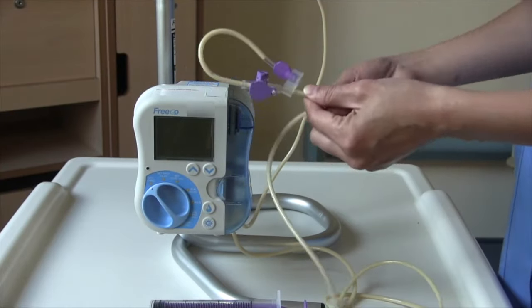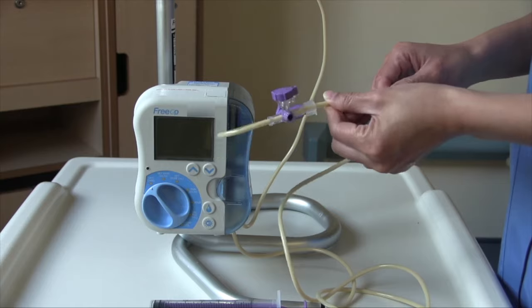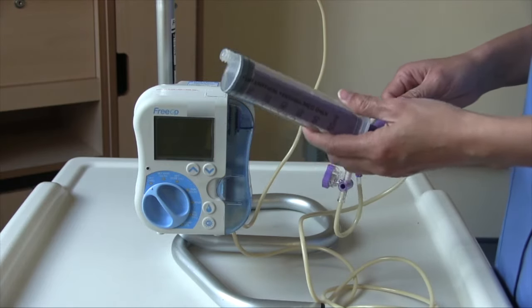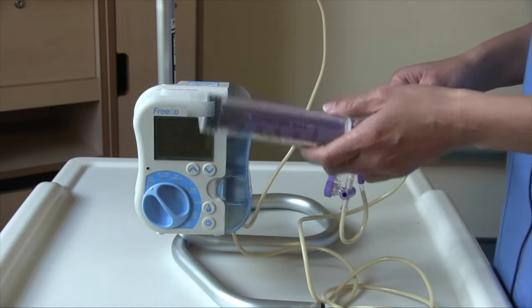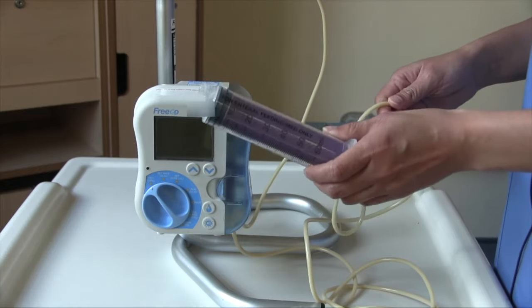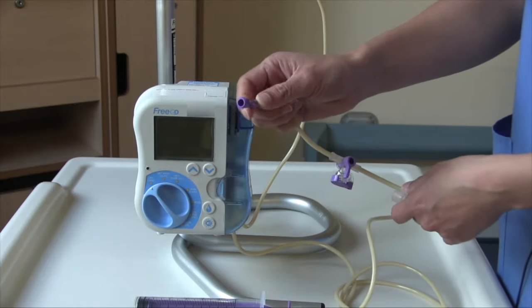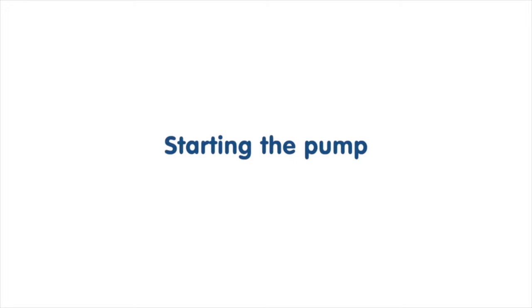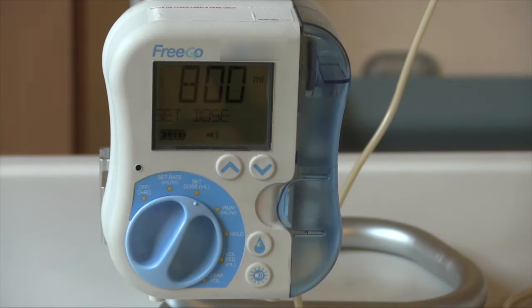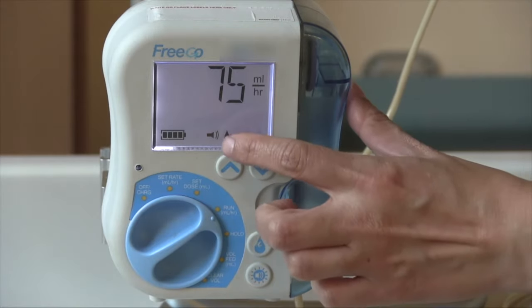After the giving set is primed and you can see the feed is near the end of the tube, and having set the rate and the dose, you are now ready to connect the giving set to your own feeding tube. But before you do this, you want to make sure you flush your own feeding tube with water. The amount of water you flush will be dependent on your feeding regime given to you by the dietician, to ensure anything left in the tube previously is flushed out and to prevent blocking. Once you have flushed water through your feeding tube, take the cap off the giving set and use a twist method to connect onto your feeding tube. Once connected, turn the dial to the setting labeled run. Once running, there will be raindrops going from left to right on screen, indicating your feed is going.